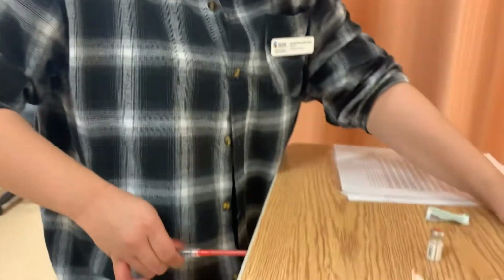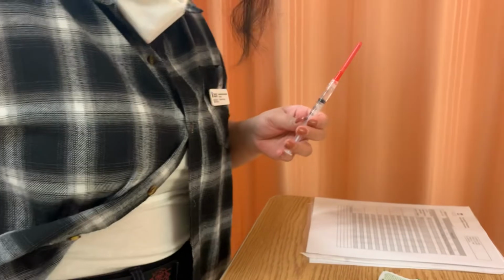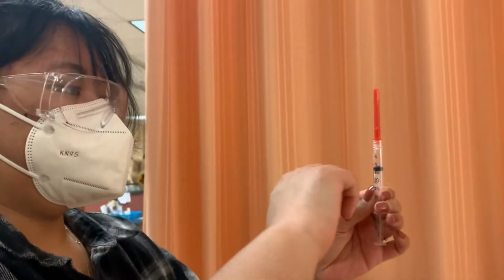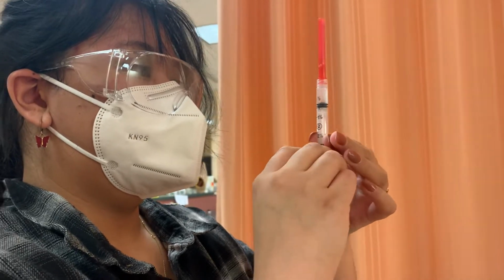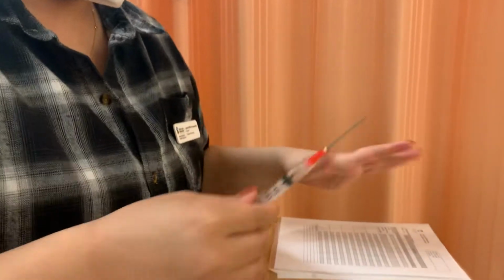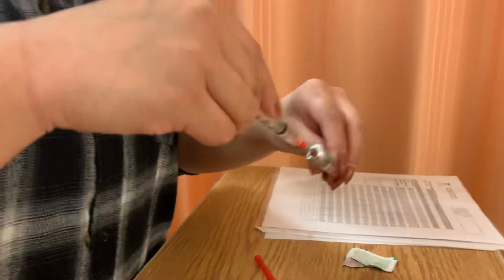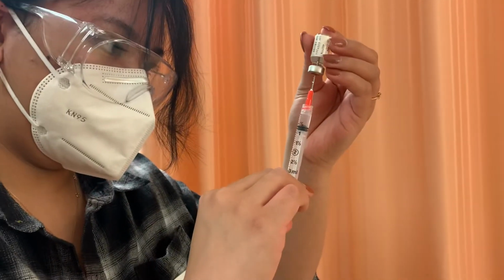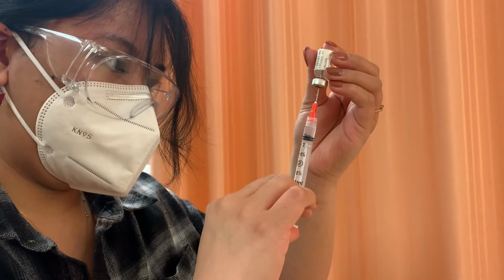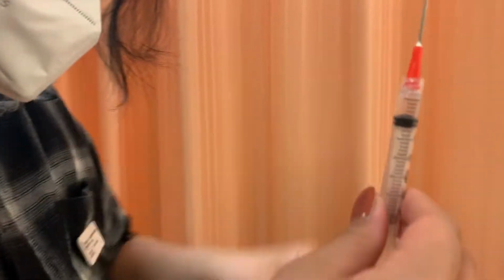Put it on the desk. Just going to get rid of the air bubbles. Hold on a pen. Oh, I got that ready. Okay. So there is excess fluid, so I'll actually be pushing this over the sink, but let's pretend there is a sink here. But for this demo purpose, I'm just going to put some back into the container. 0.5 ml. Okay. I have 0.5 ml.